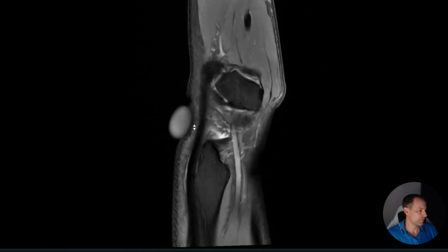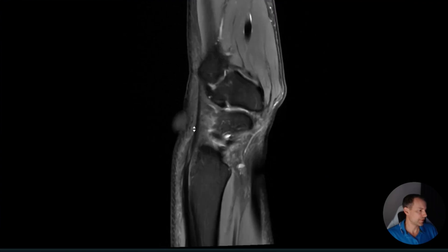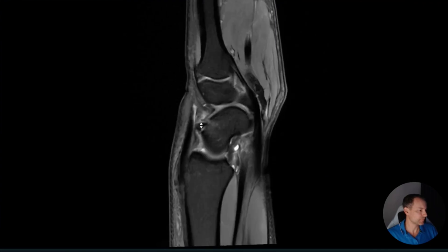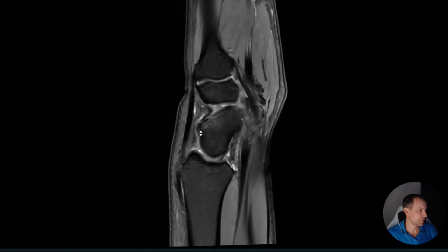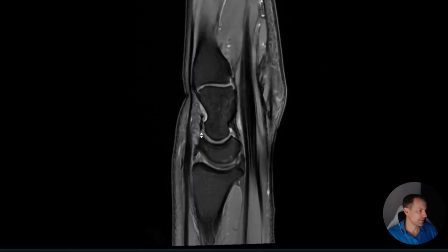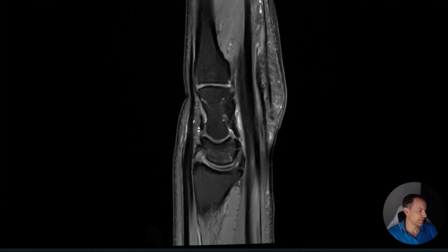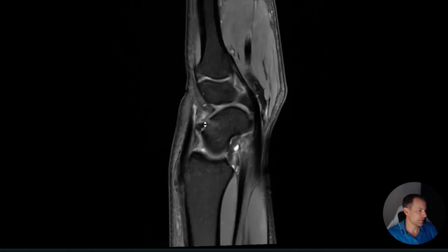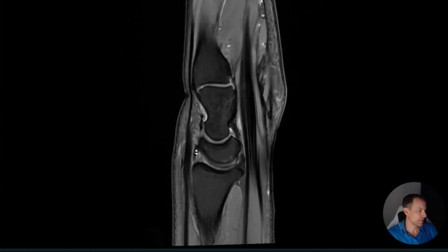Going from radial to ulnar, we can see there is the pain marker right at the bony ridge, and this is exactly where the dorsal intercarpal ligament inserts, or at least part of it.